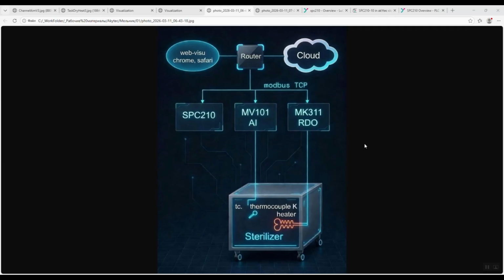Now let's take a look at the structural diagram of the equipment we'll be using to solve our task. As we already mentioned, a programmable controller SPC210 is used as the controller to which two input-output modules are connected via the Modbus TCP protocol. The analog input module MV210101 is used to connect a thermocouple that measures the temperature inside the sterilizer. And the two relay outputs of the MK210311 module are used to control the heater. All the devices mentioned are connected to each other through a router that has internet access. This will allow us to demonstrate the operation of web visualization, as well as connect the SPC210 controller to the akYtec cloud service.